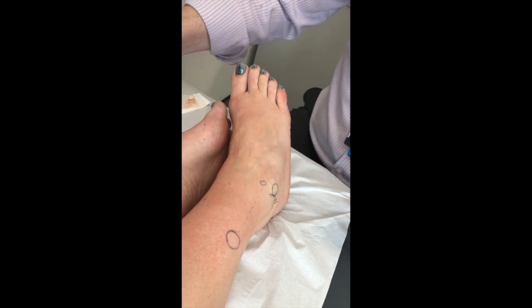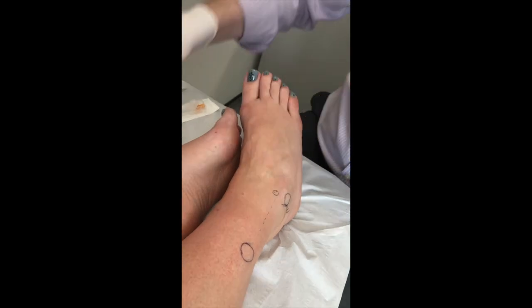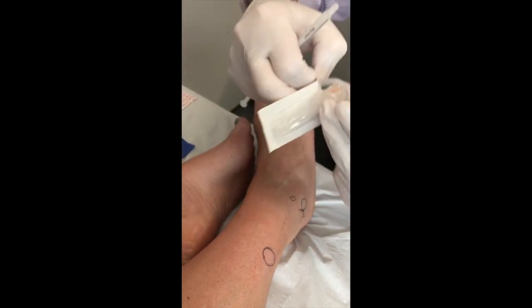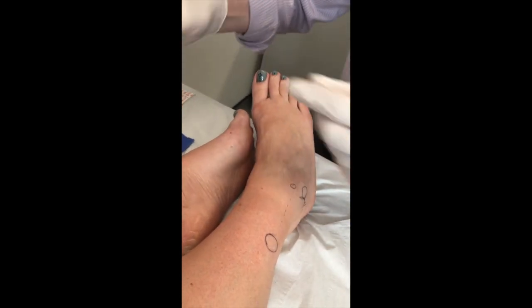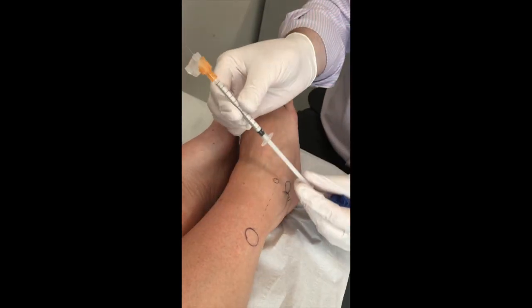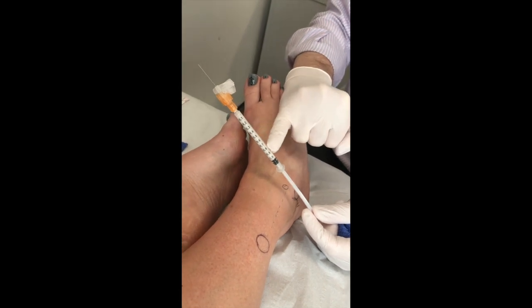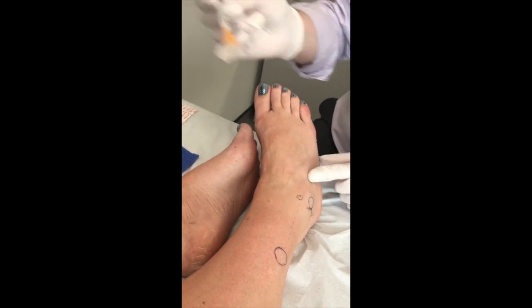Rebecca, NHS or private patient? You're a private patient, aren't you? So we're going to use a fresh needle because she's a private patient — and a nice skinny one. Not the ones we use for our NHS patients. I'm joking, of course. But I'm not really. So I've already mixed up a little bit of local anaesthetic. This is a 50-50 mix of Depomedrone for soft tissues and a little bit of local anaesthetic. Let's give it a little mix.